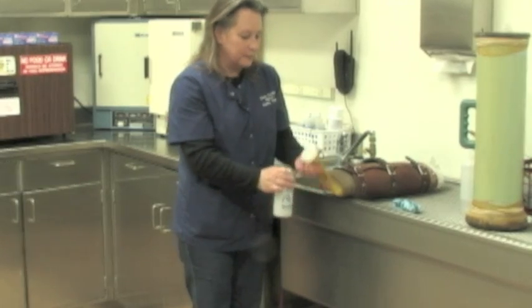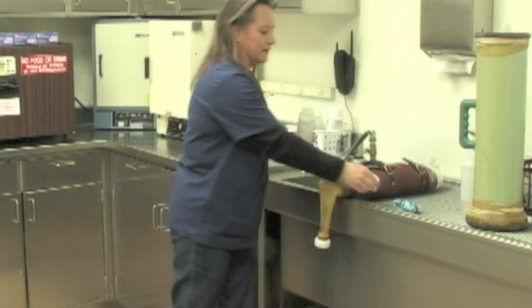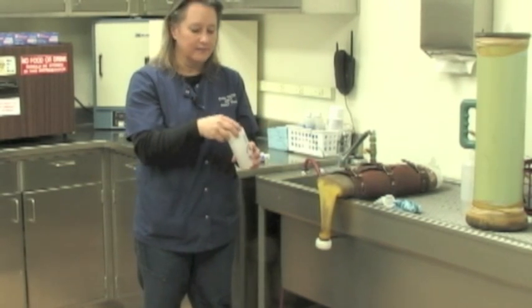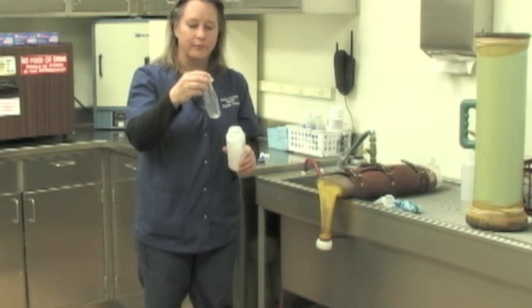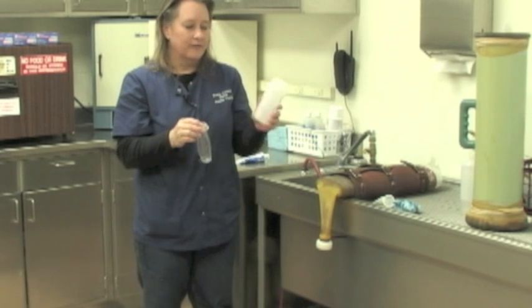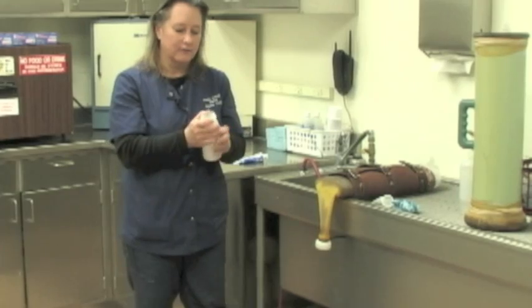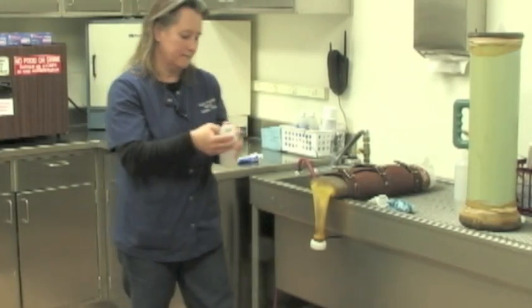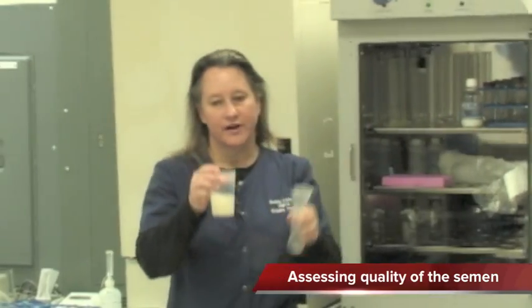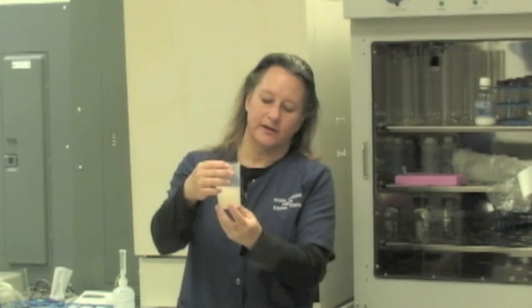Once we've collected semen, we'll remove the collection bottle and remove the gel filter that contains the gel. The gel is found at the end of the ejaculate so it does not contain the sperm. The sample is then collected into the baby bottle liner which holds the semen. This bottle is just used as a holder for that liner and then we can take that out and utilize it in the laboratory. We'll actually pour the collected semen from the baby bottle liner into a specimen cup and then assess the quality of the semen.